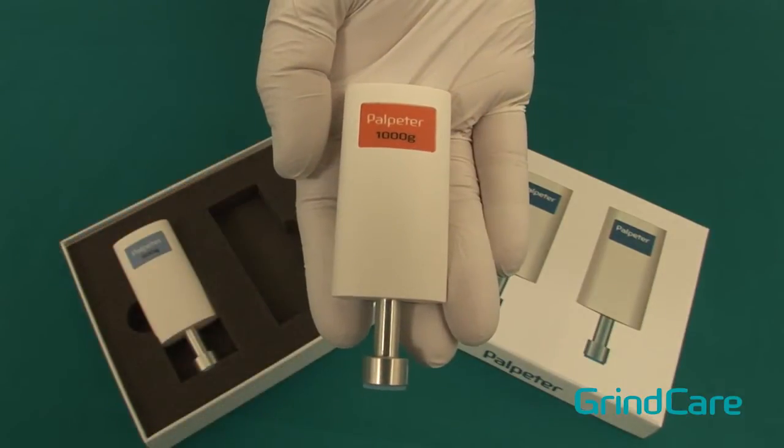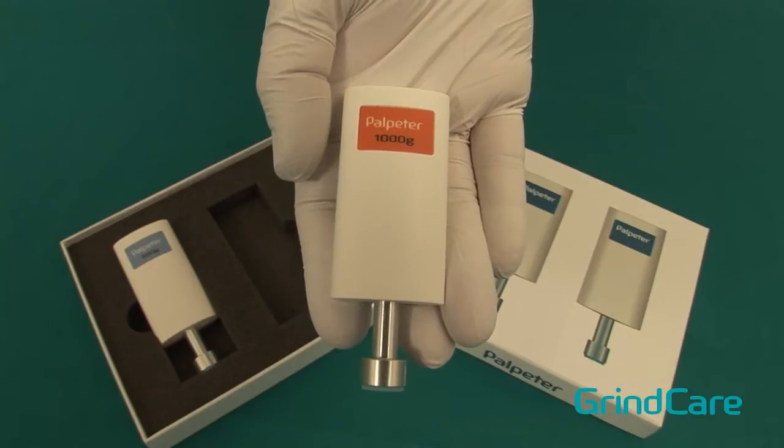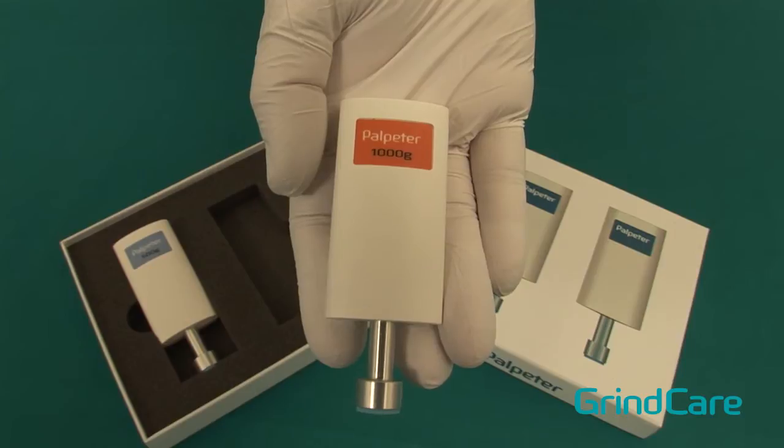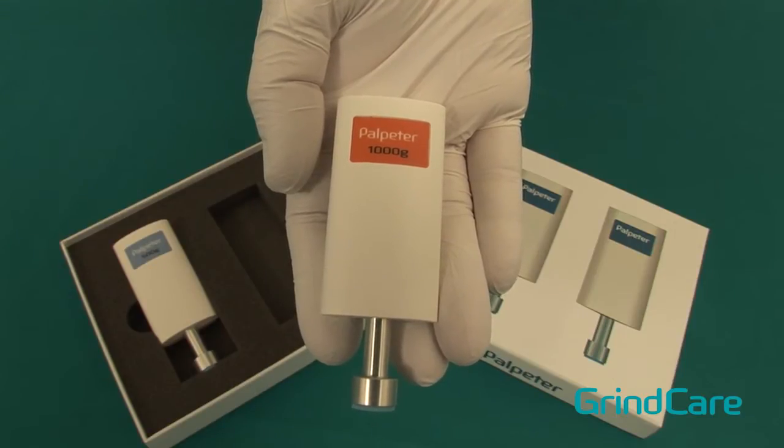The 1000 gram, or 2 pounds of pressure version, is used for palpation of most of the extraoral muscles — for example, the temporalis and the masseter muscles.